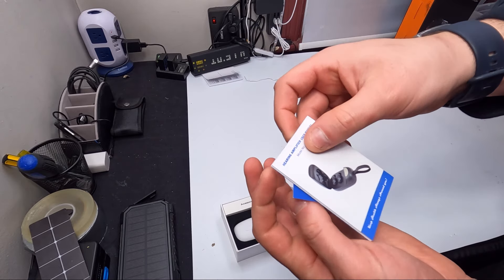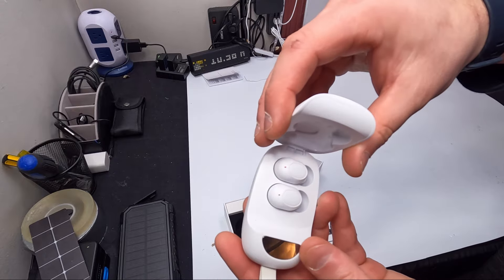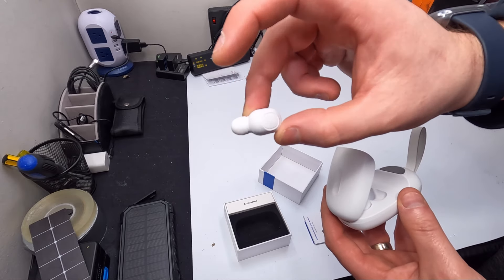Inside there's a nice little manual, a carrying pouch, and this is what they look like. They almost resemble earbuds.